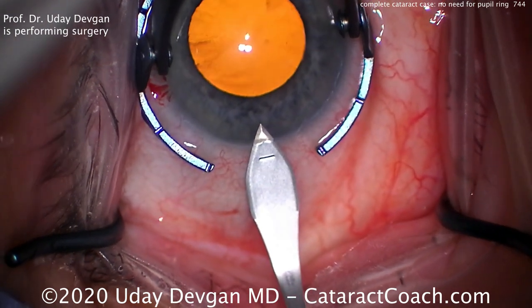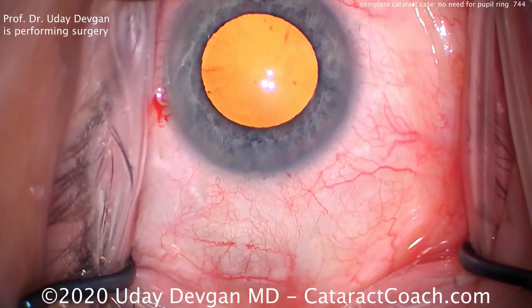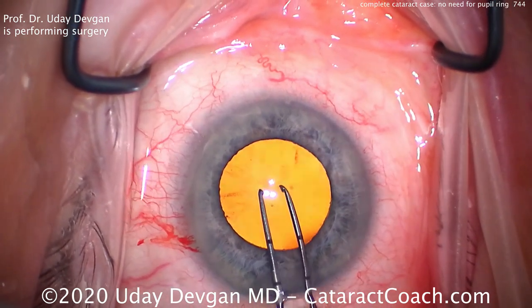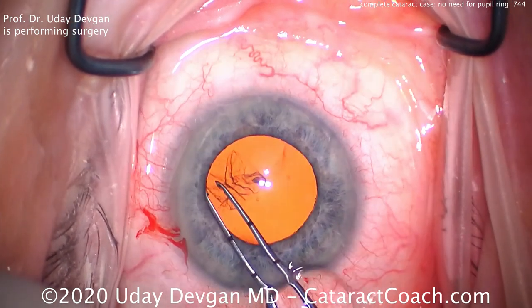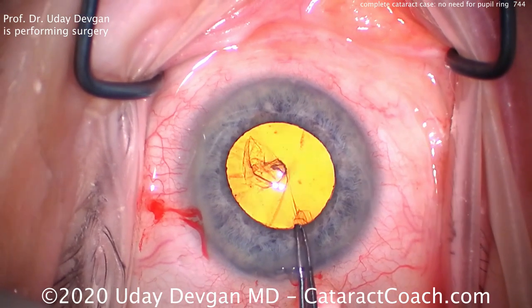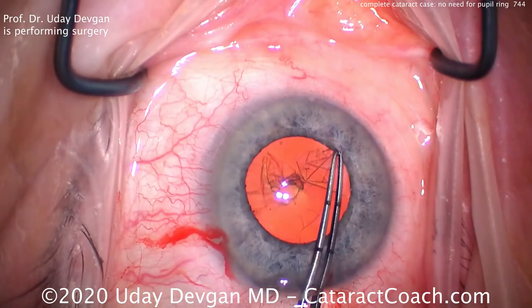Making the main incision here, steel keratome being placed there temporally, a nice single plane incision with a nice tunnel length — that looks good. Now important to get a good capsulorhexis. We want about a five, maybe five and a half millimeter capsulorhexis. Measuring there with the forceps, it also shows us that the pupil dilation is just a little bit more than five millimeters. This is a hyperopic patient, a small eye, the white-to-white's a little smaller. So if we trace this rhexis just about at that pupil margin, that should give us about a five millimeter capsulorhexis, and that's going quite nicely.